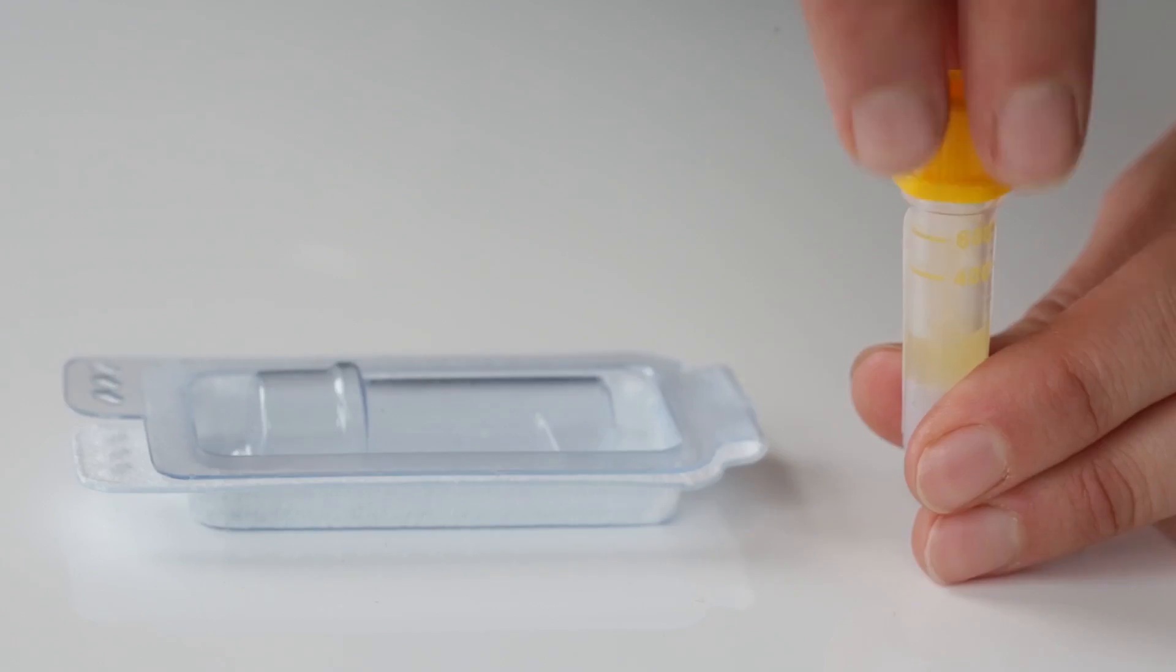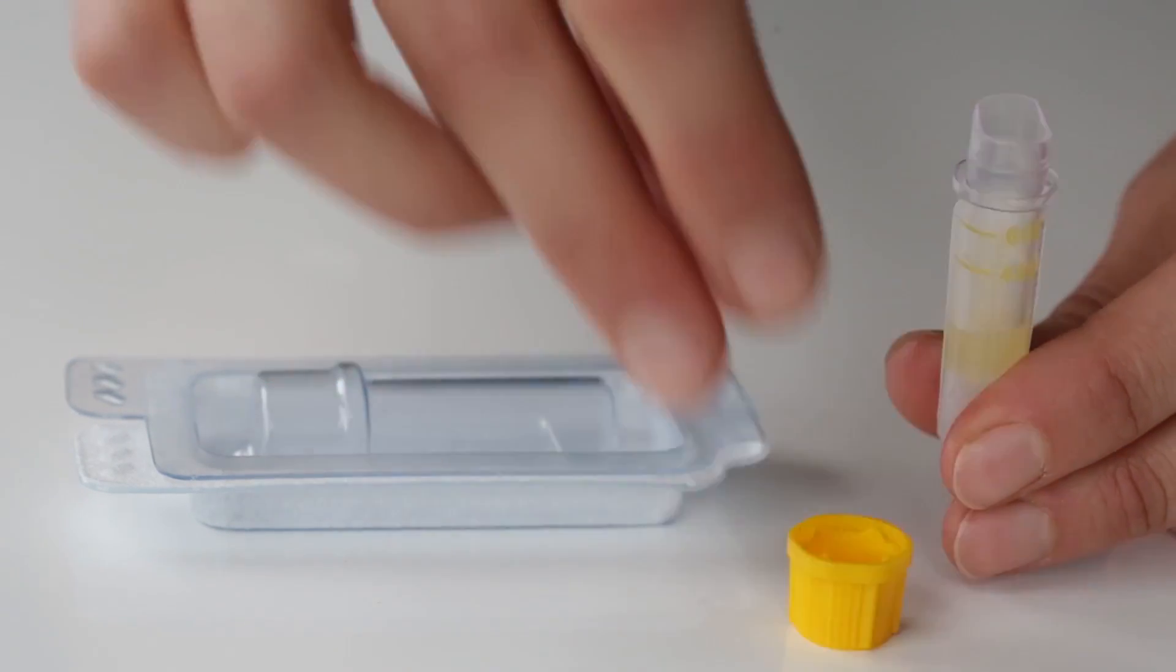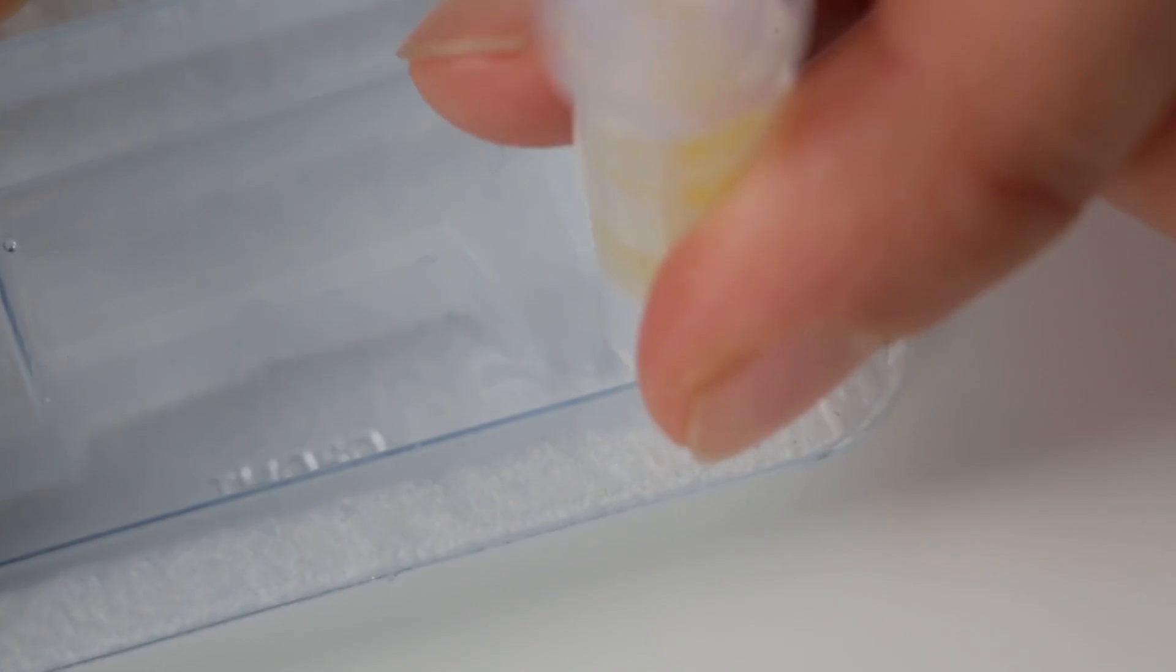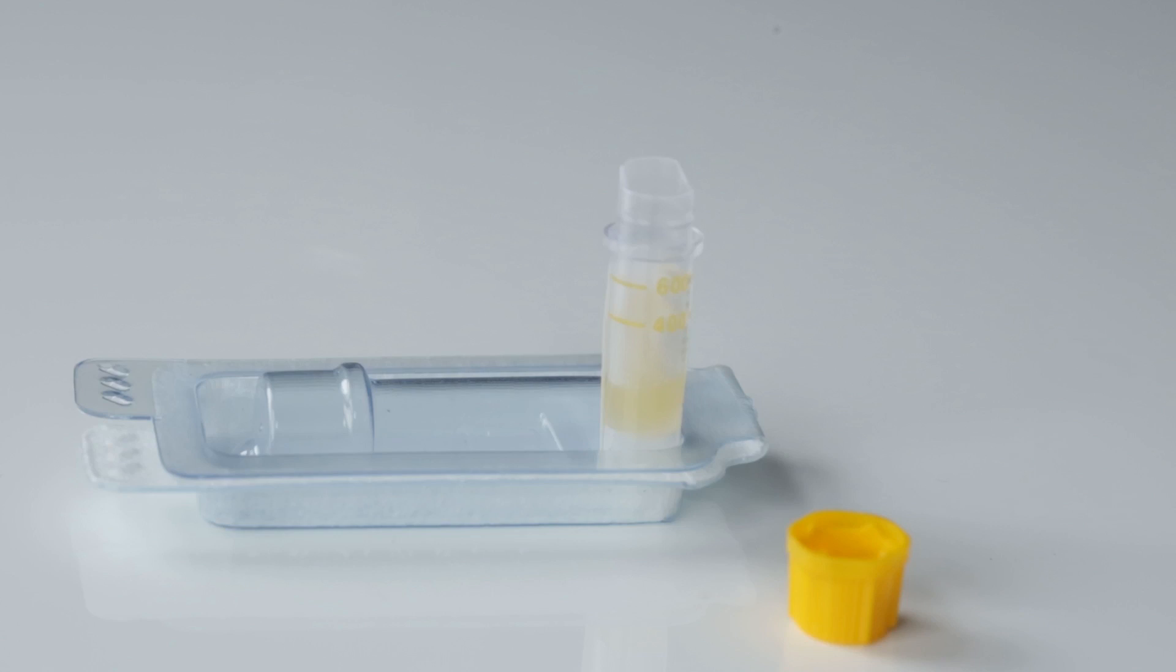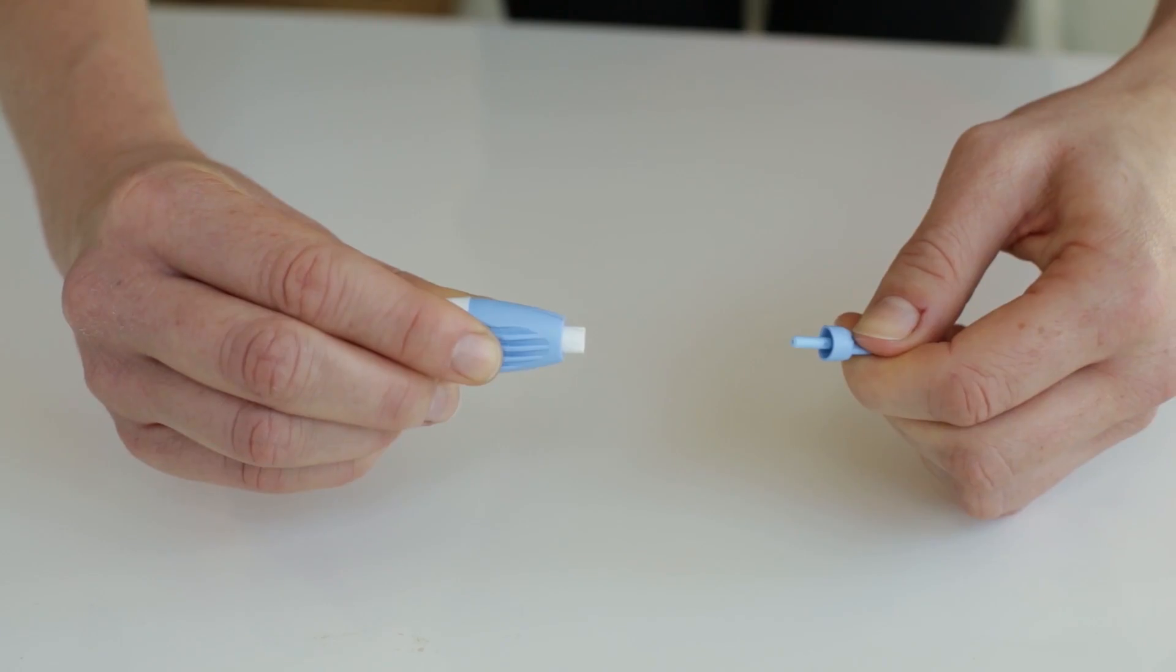Take out the sample tube and remove the yellow cap. Stand the tube in the closed packaging. Twist and pull the blue tip off the lancet.